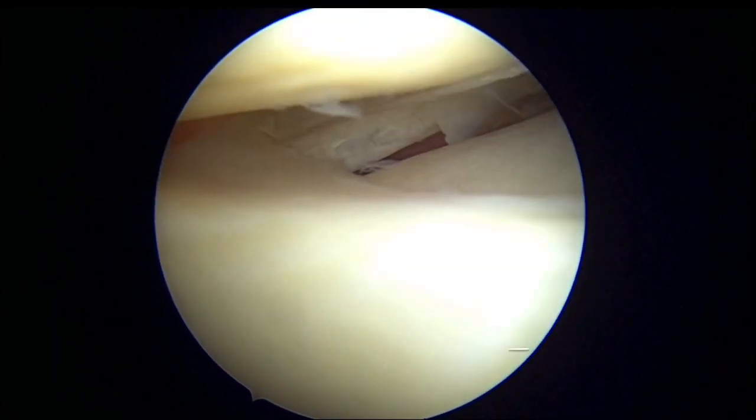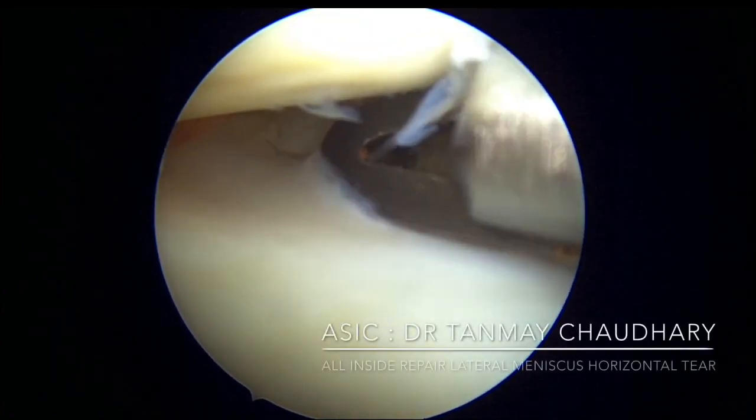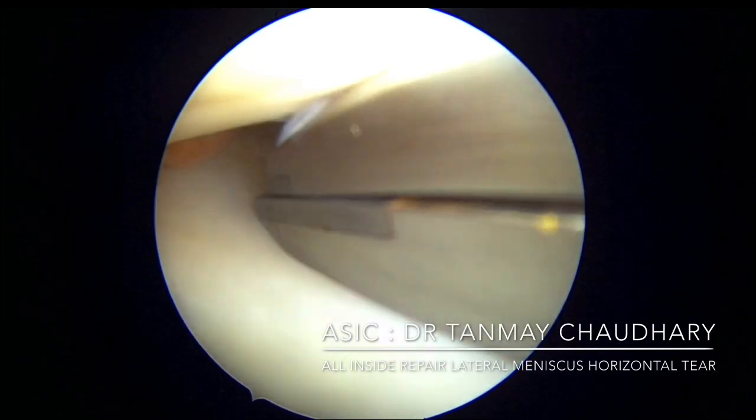Once you are sure of the repair, you can remove the remaining suture with the suture cutter.